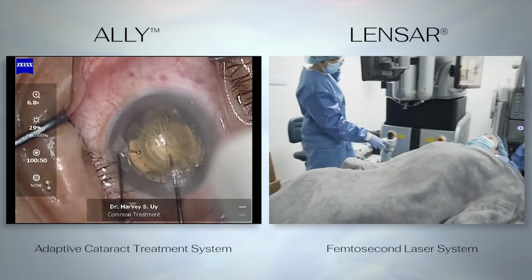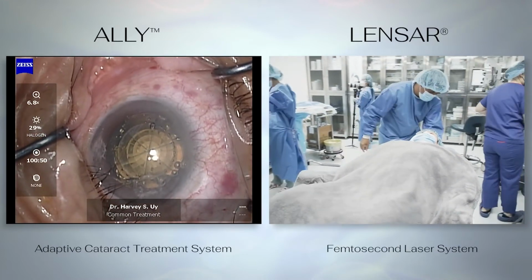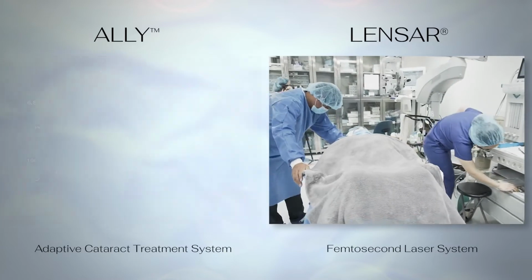So opening these wounds takes up less effort. The clear corneal incisions are generally effortless, and we're able to proceed with this surgery.